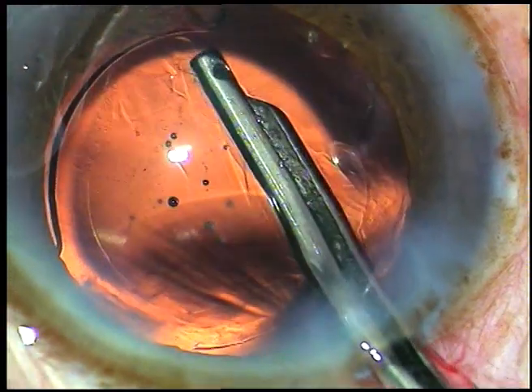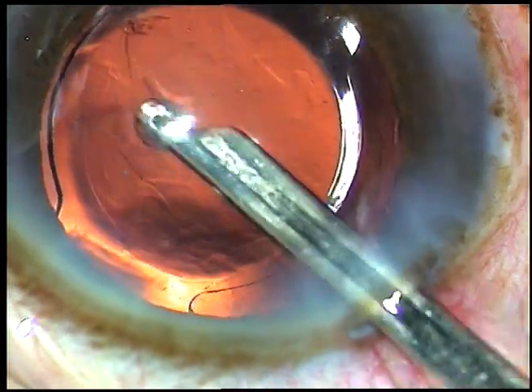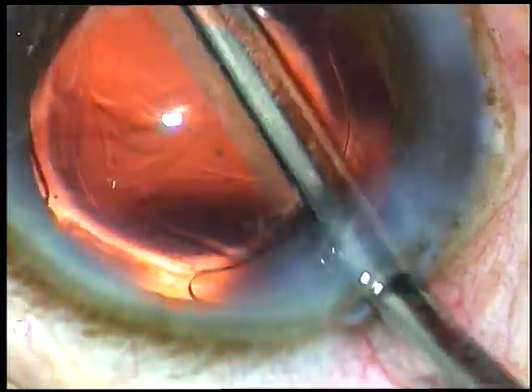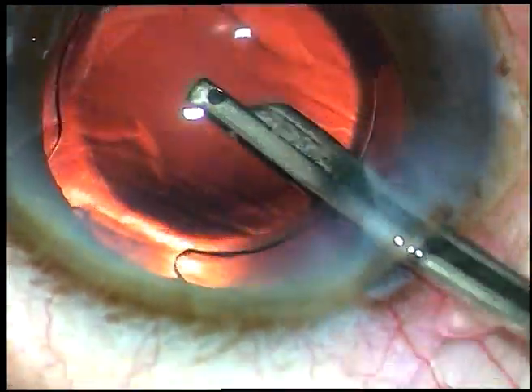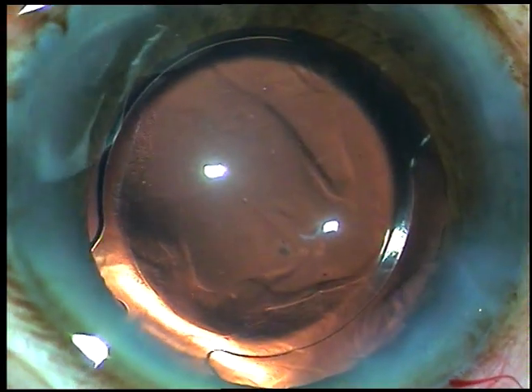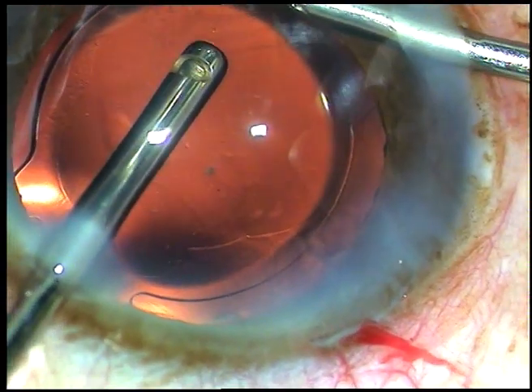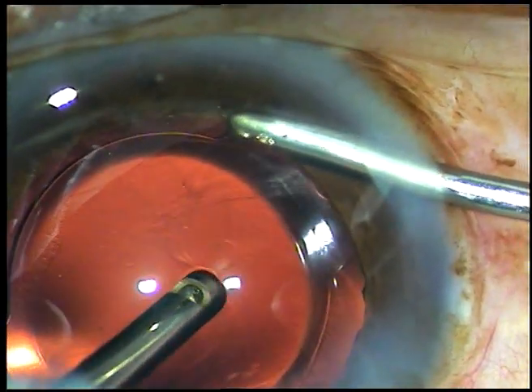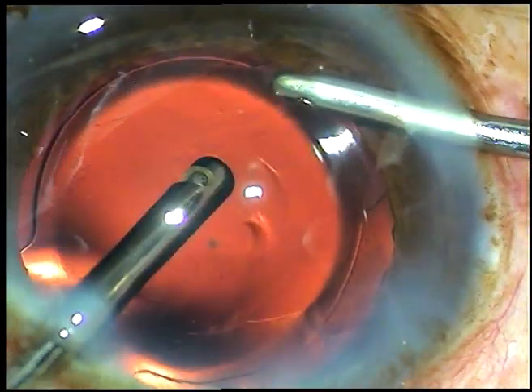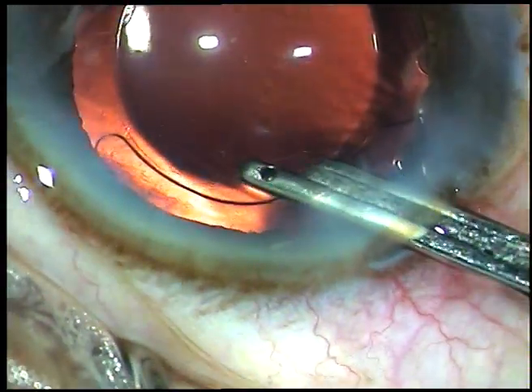The cortex from 6 o'clock has been removed. Since vitrectomy has been done, I am sure these are cortical fibers. I was doubtful that there are any remaining vitreous strands at 6 o'clock, so I went again with the cutter and removed those fibers as well as the viscoelastic substance with the cutter itself.